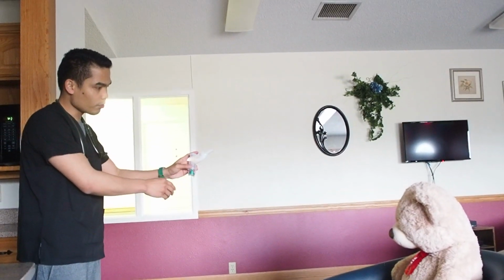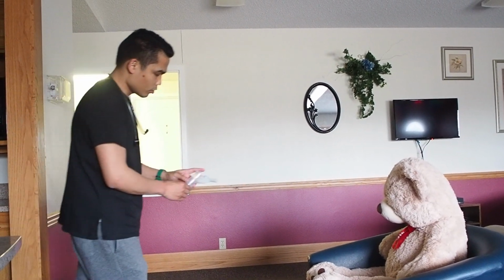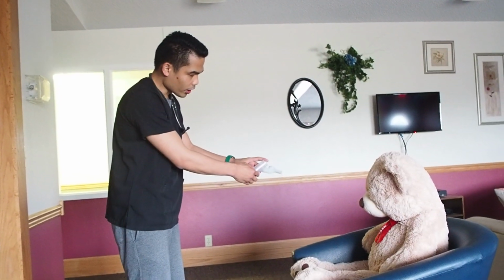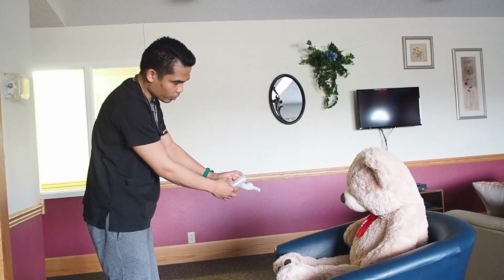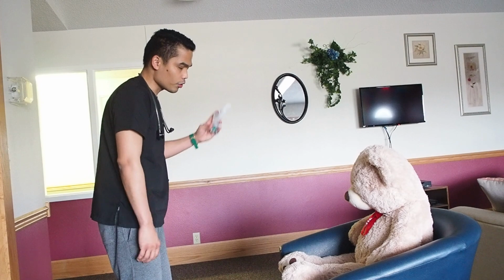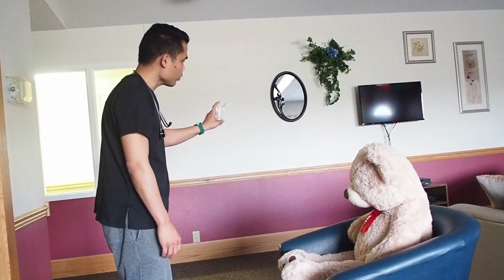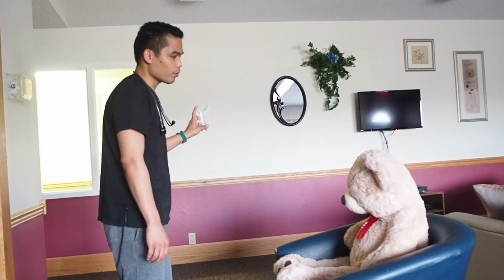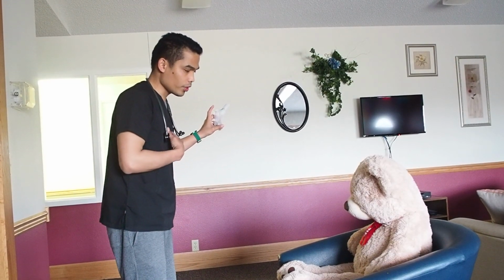This one here in front of you is the metered dose inhaler. You're going to position your hand with your index finger on top and your thumb underneath for support. You're going to shake the device for at least a few seconds and then prime the dose away from you, just once, or actually press, and after that you exhale your air out until you feel your lungs are empty.